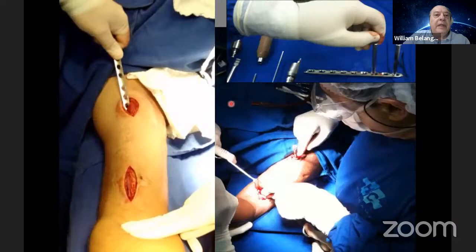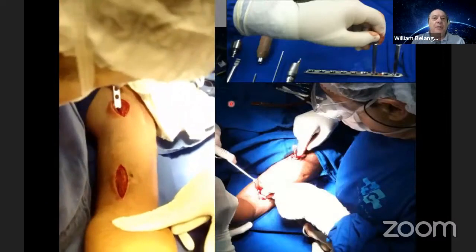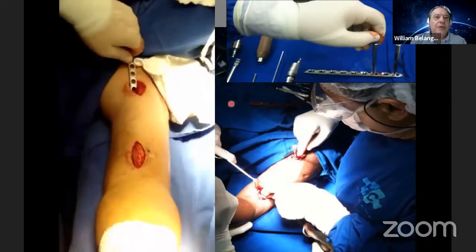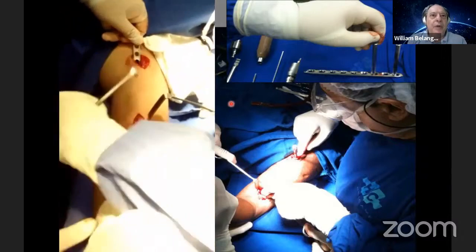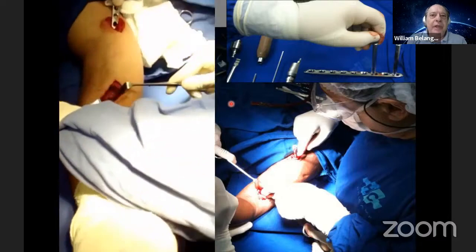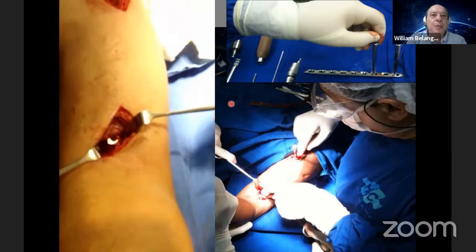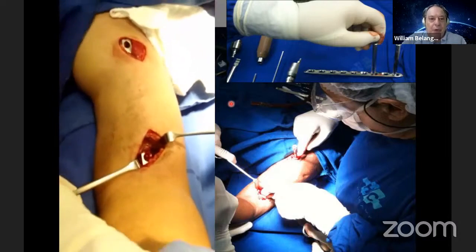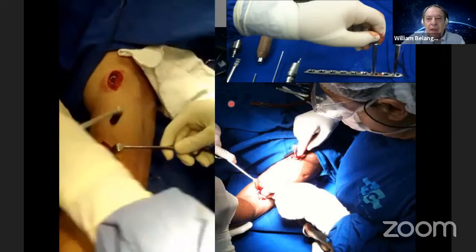It's important to slide the plate from proximal to distal, below the flexor muscles. During the plate introduction, it's very important to maintain the bone alignment by traction, keeping the elbow joint in flexion and the forearm in supination to keep the radial nerve away from the plate in the distal approach. You see here the plate on the distal window.